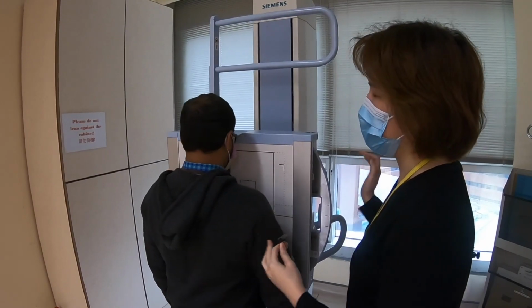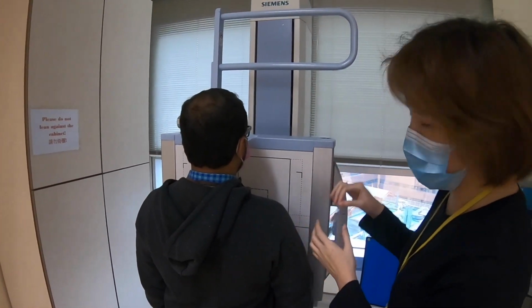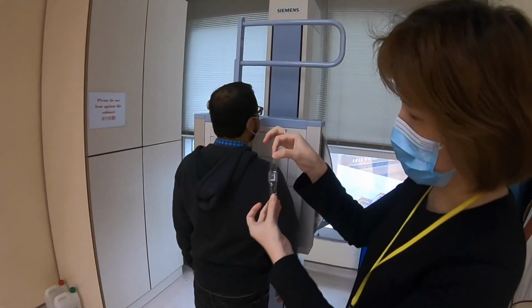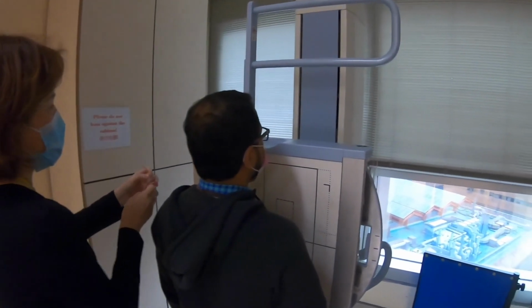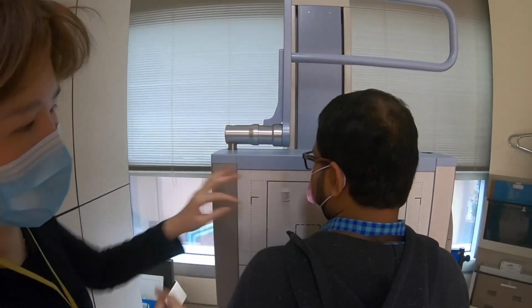So let's take chest as an example. If we are doing a PA chest for him, what we need to do is use a PA marker, just like that. And of course we put it into the corresponding side, which is a left marker. So I'm going to put it on his left side. Okay, this is called a PA marker.